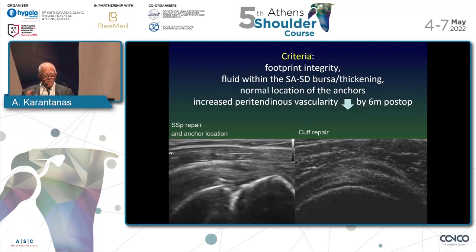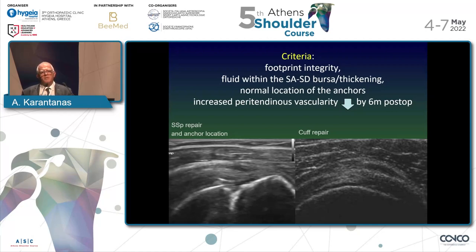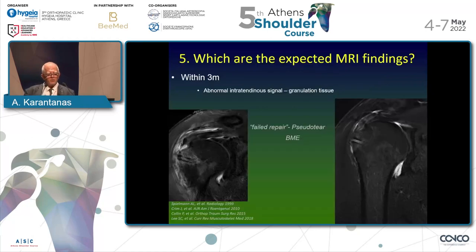The position of the anchor has to be the expected one — we see it into the bone together with a suture. These are the normal appearances. Sometimes with Doppler we have some neovascularity peritendus which drops down significantly by six months postoperatively.